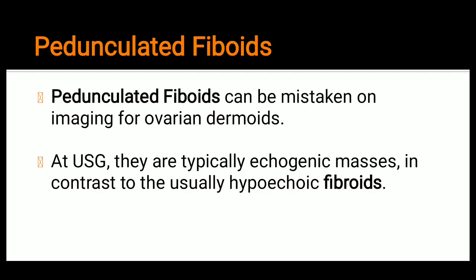Regarding pedunculated fibroids — patients may have pedunculated intrauterine fibroids. On ultrasounds which are not of good quality, you may see what appears to be increased endometrial thickness. But if we use a good quality ultrasound scanner, you can identify and diagnose pedunculated fibroids. They can be mistaken on imaging for ovarian dermoids because of the different types of shadows present. That is why pedunculated fibroids are usually missed for ovarian dermoids.